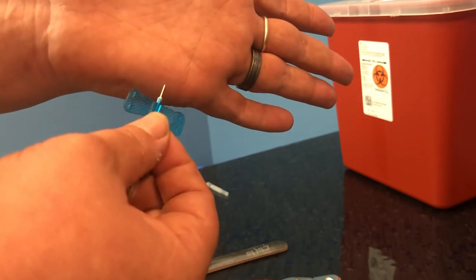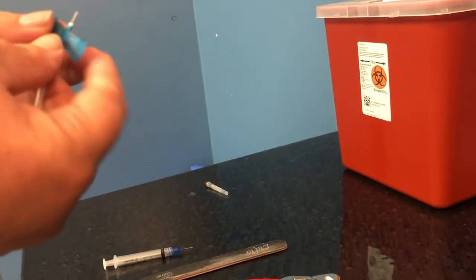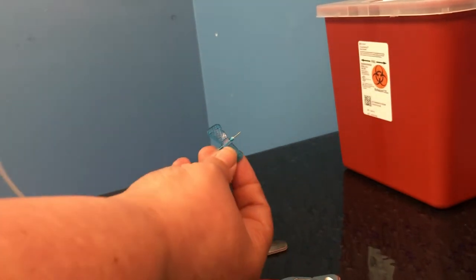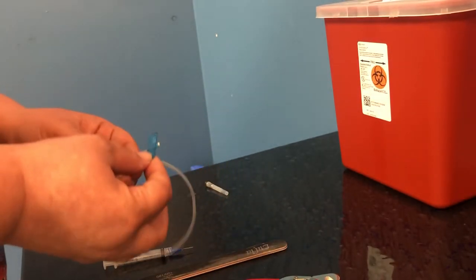This particular one is 23 gauge. And remember I said with the smaller the needle, the more pokey it will feel, the more intense the stimulus. This one is the second most intense one that we use for training purposes.